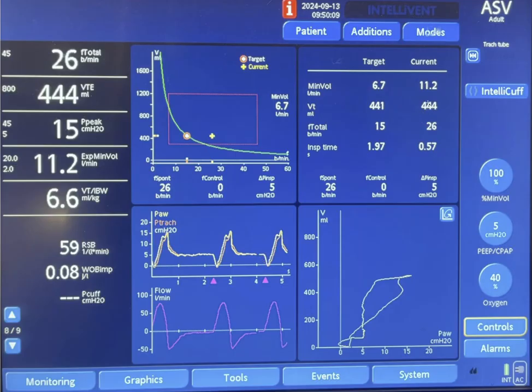So now what the patient is doing is the following. This is his tidal volume which is at target. However his respiratory rate is higher than the target. Of course there is no way for the machine to lower that respiratory rate.